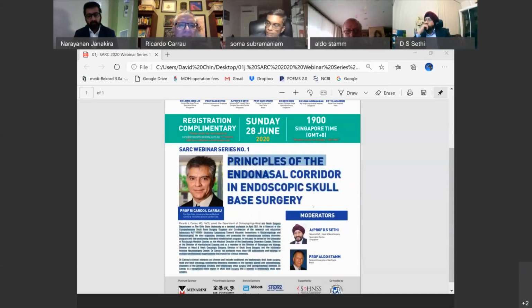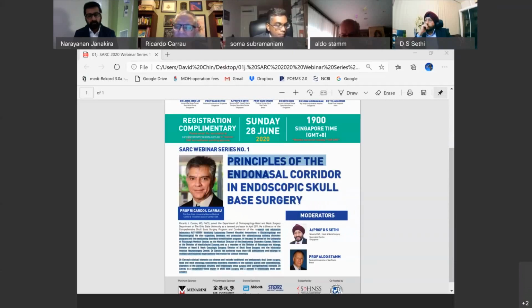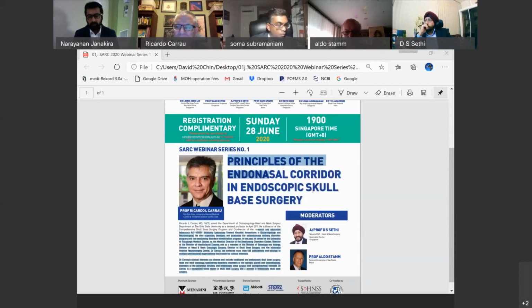But as an instrument, the coarse diamond drill is the most dangerous instrument for the internal carotid artery. Especially where we have a very thin bone, it can destroy the dura completely and produce a lesion of the internal carotid artery. This is my recommendation. It's an excellent instrument, but near the carotid artery it is really a dangerous instrument for me.